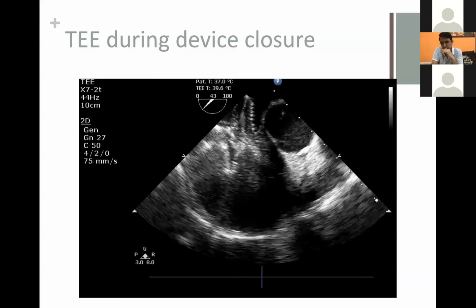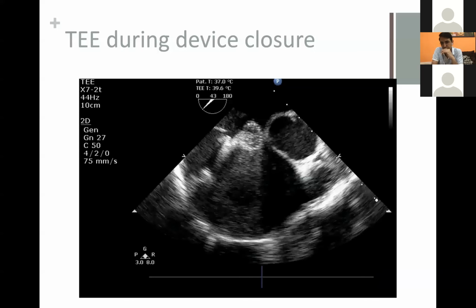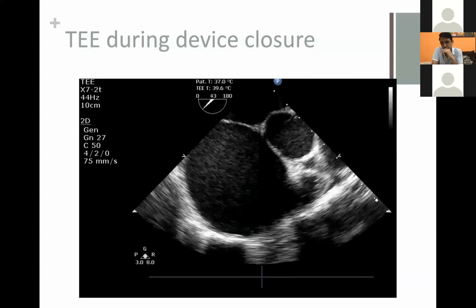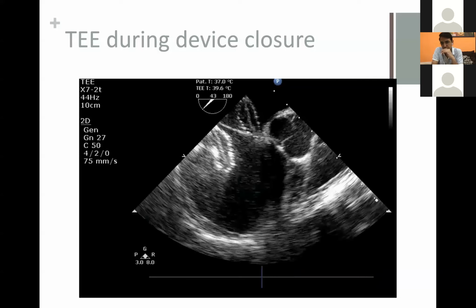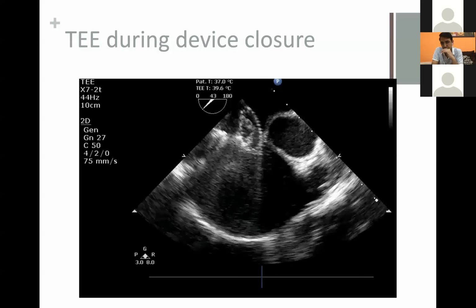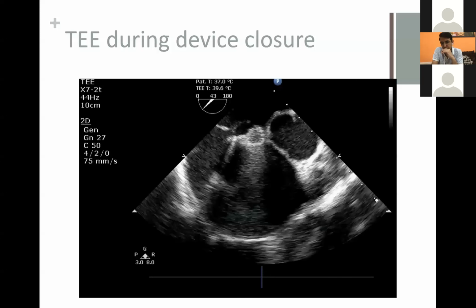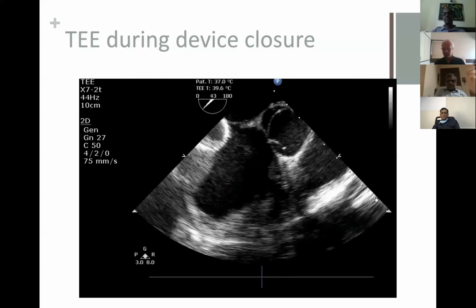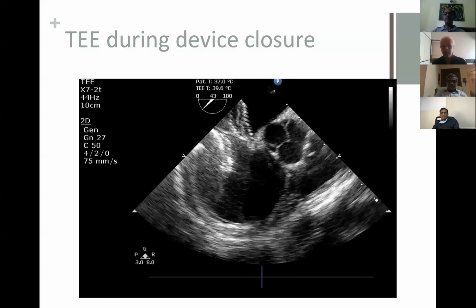We all know that the CT scan spatial resolution should be far more inferior, especially when there are thin and flimsy margins, and more so if it is a very mobile atrial septum, as in the case of an atrial septal aneurysm. Your thoughts about it? Yeah, CT is much inferior, as you just suggested, sir.